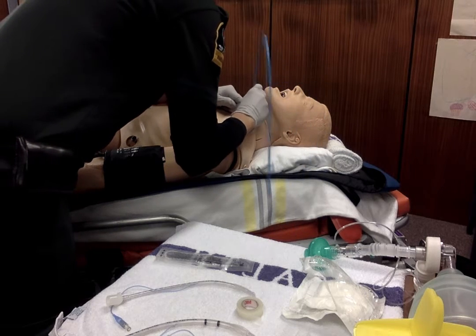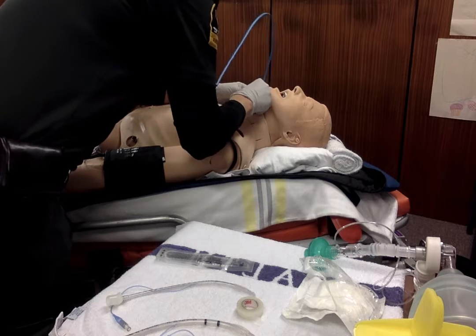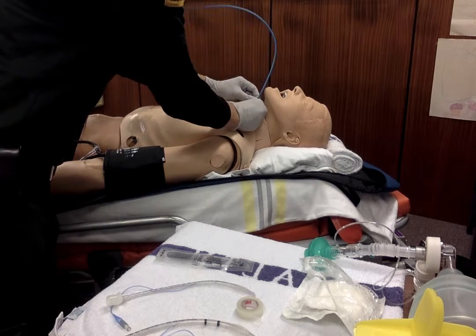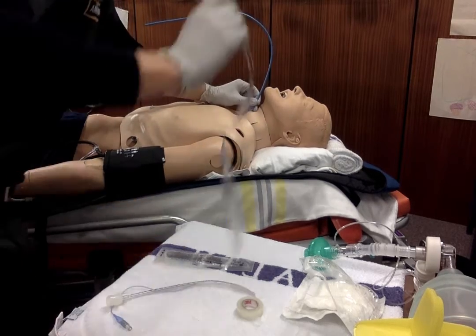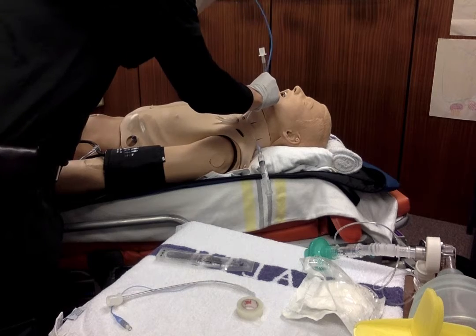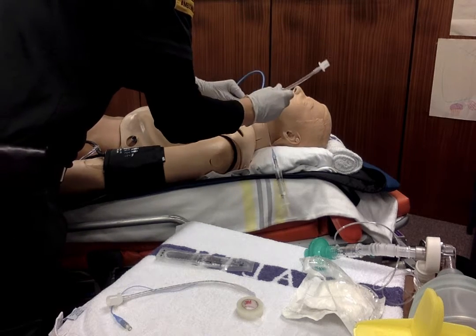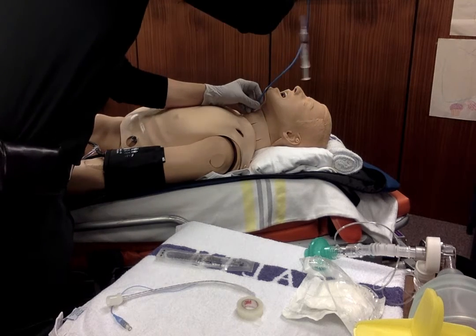With the bougie, I'm going to sneak it in beside where the finger is, into the right hole. You may feel the cartilage kind of rings as you go down. An airway assistant would be awesome, but if you don't have one, keep hold of that bougie and railroad your tube over top as best you can.